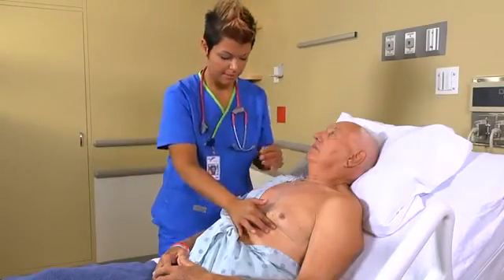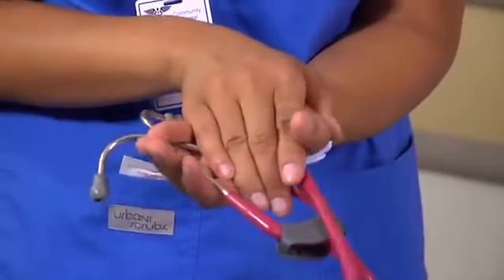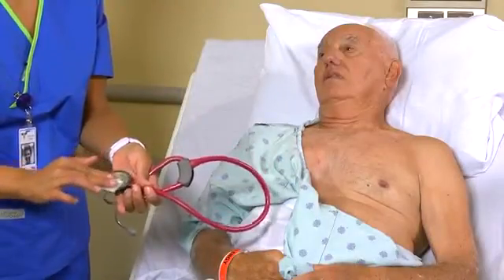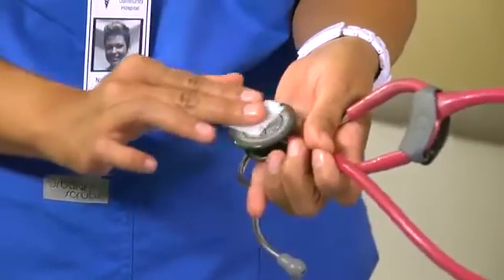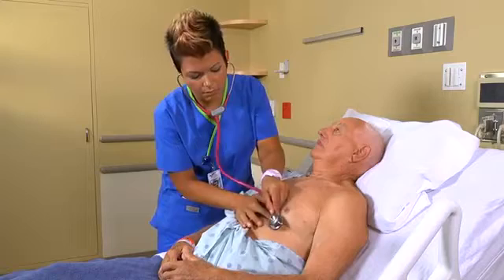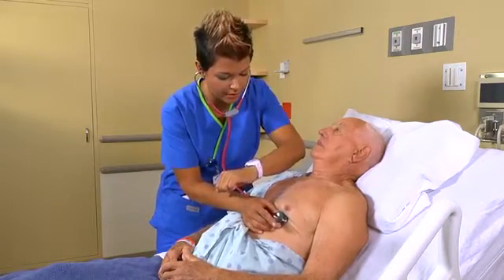Now that I've found the spot, I'm going to go ahead and take a listen with my stethoscope. Next, warm the diaphragm of the stethoscope in the palm of your hand for 5 to 10 seconds. Then clean it with alcohol and allow it to dry for 30 seconds. Place the warmed diaphragm of the stethoscope over the PMI and auscultate the normal S1 and S2 heart sounds — lub-dub, lub-dub.